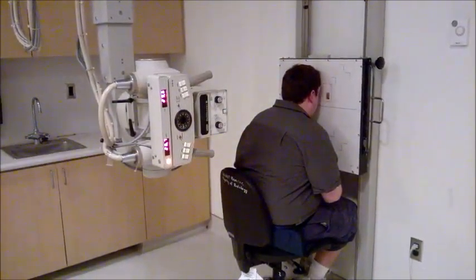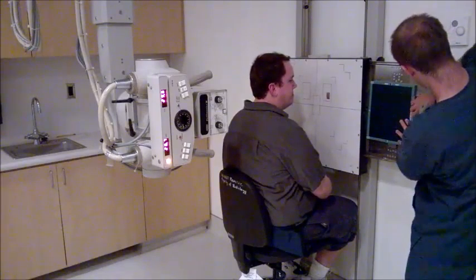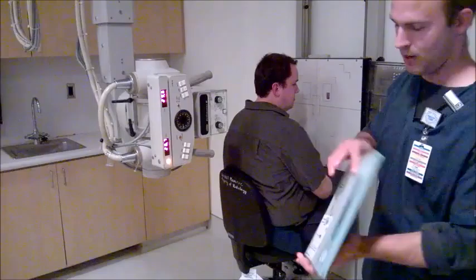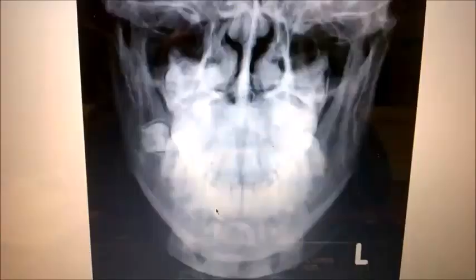Stay just like that, sir. Beep. All right, now I've taken my picture. You can relax, sir. I've taken my picture. Now I'm going to check this. I'm gonna scan it and then read it. I'm gonna do this with all of my exams.